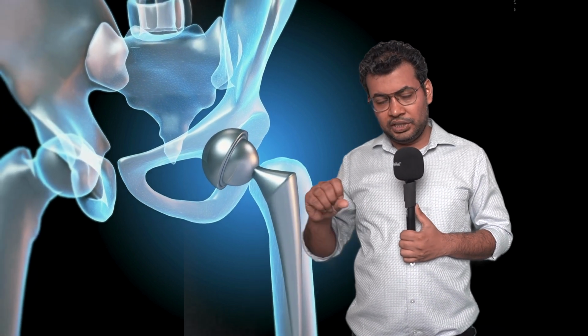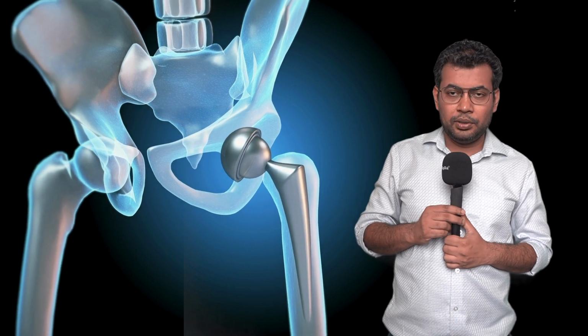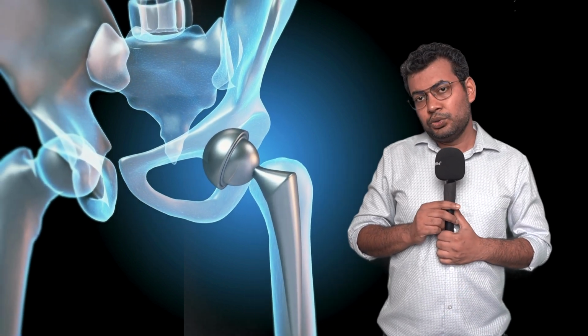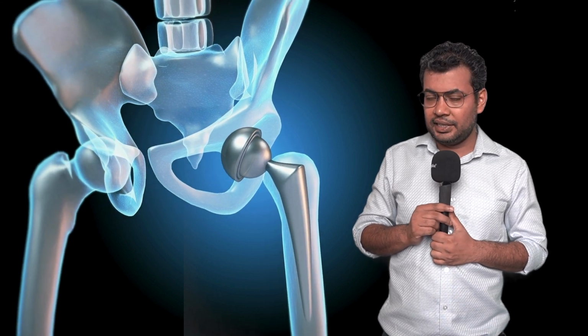So here we rotate the femur on the posterior aspect, so that we can make the medial structures taut, and then we start cutting the medial muscles. So the attachment of the adductors on the femur. We again keep a cuff of around a centimeter and start cutting the muscle.